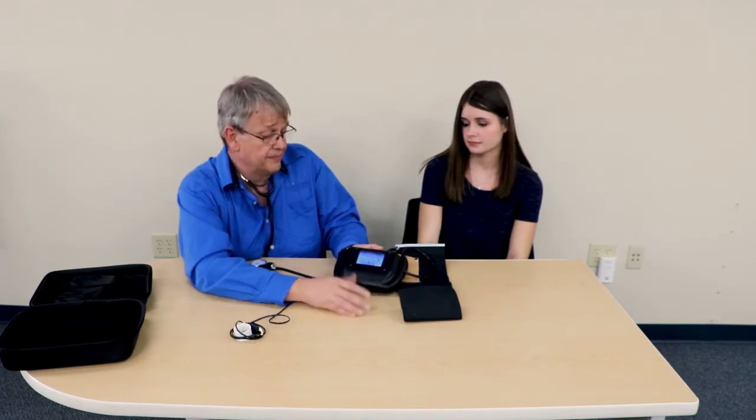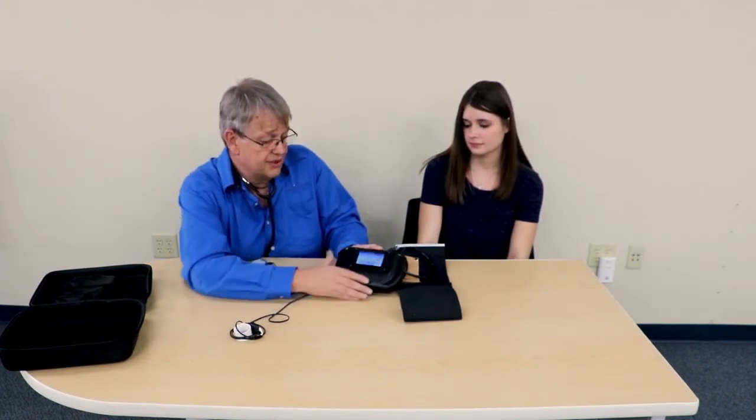I press the save button, hit the right arrow button, and go to edit test value two screen. I'm going to set the systolic to 120, the diastolic to 80, pulse rate at 60, and volume again at 9, but this time I am going to set the auscultation gap, and then press the save button on that as well.